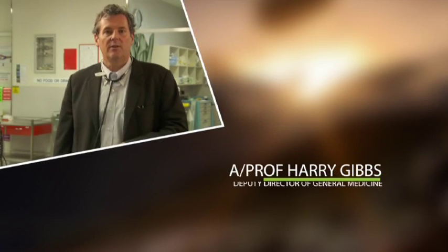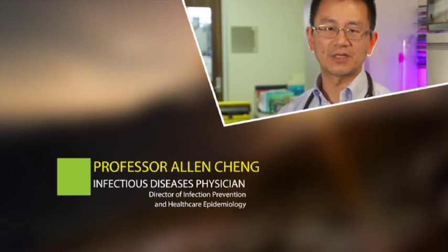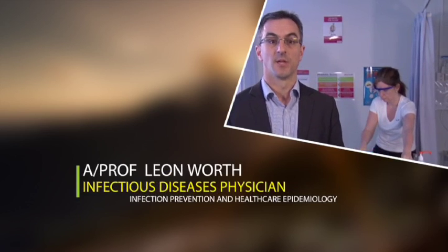So that every effort can be made to prevent harm and preserve the future venous access needs for all our patients. That requires weeks of antibiotics with a 10 to 20% chance of death and is regarded as totally preventable. Our aim is that you will role model excellence by demonstrating and encouraging best practice amongst your colleagues in the care and the insertion of peripheral cannulae should be performed under aseptic conditions using a recommended skin antiseptic.